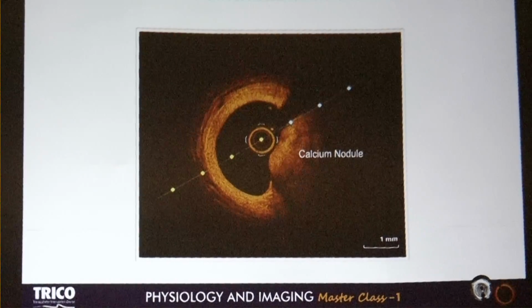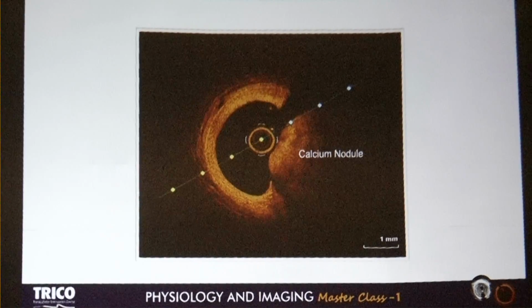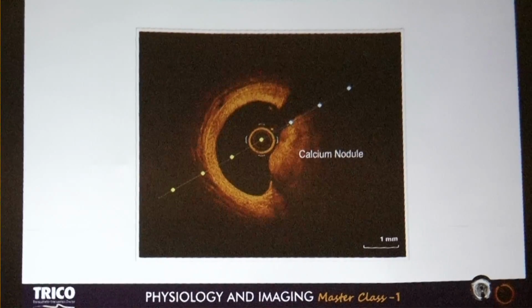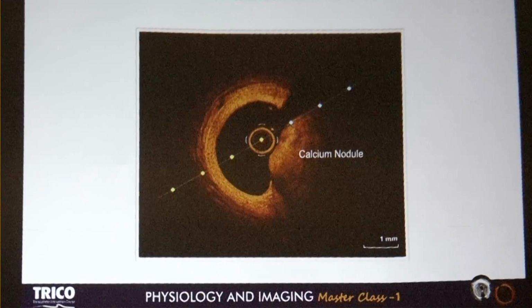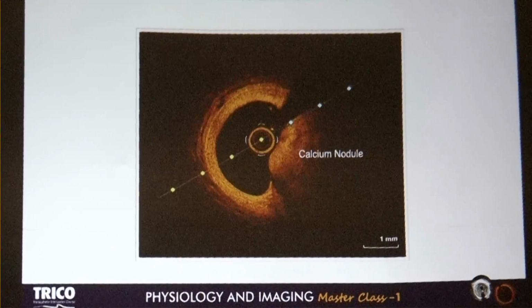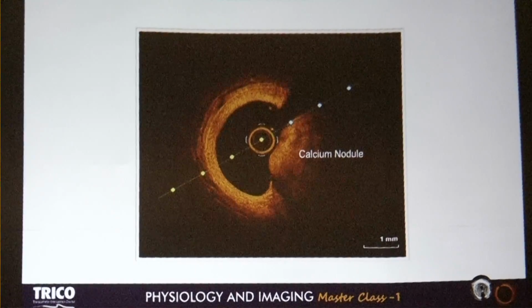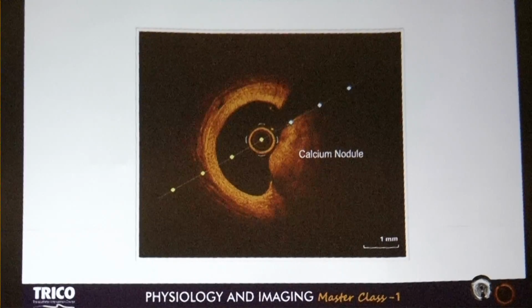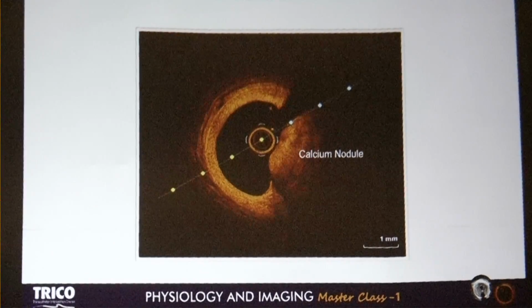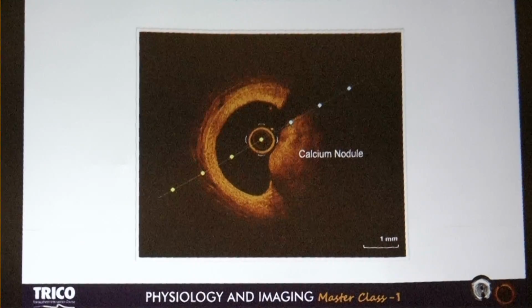Another important thing: we do imaging because we want an excellent cosmetic result, right? By and large. Here, imaging should have helped me eliminate this complication-prone nodule, giving a not so good and a little bit ugly image on angio, but I would have known that my patient is going to remain very stable, had I deployed the stent just distal to this nodule.